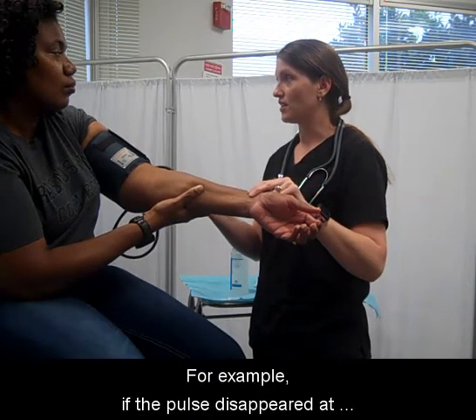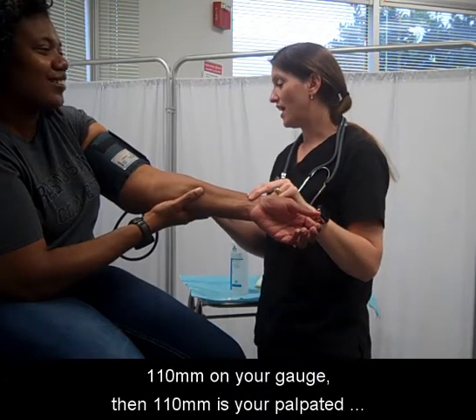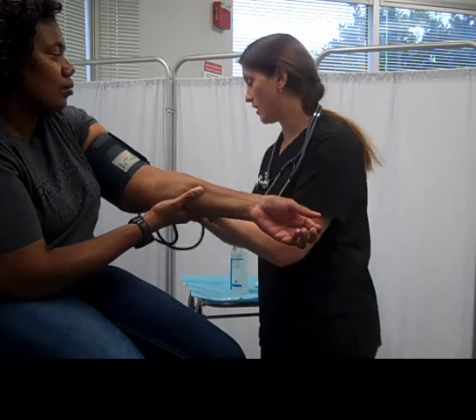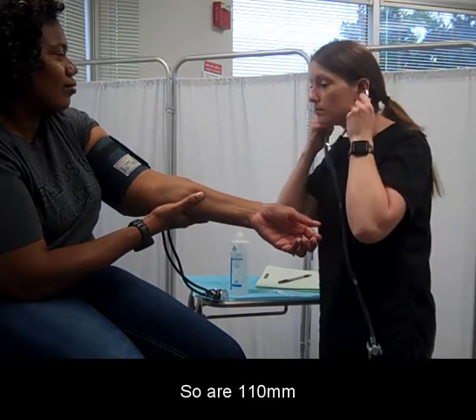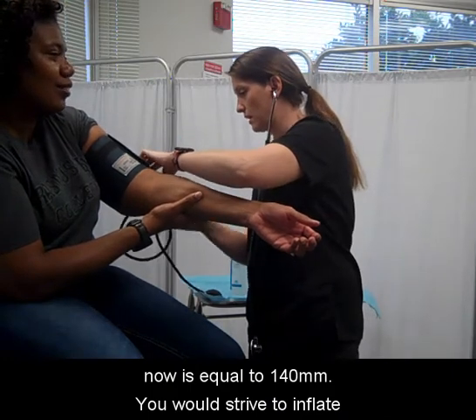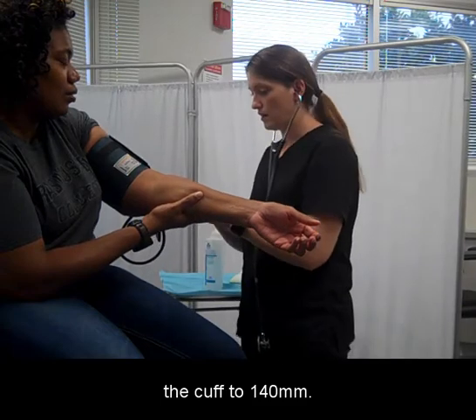For example, if the pulse disappeared at 110 on your gauge, then 110 is your palpated systolic blood pressure. Typically, you will then add 30 to that number. So our 110 now is equal to 140. You would strive to inflate the cuff to 140.